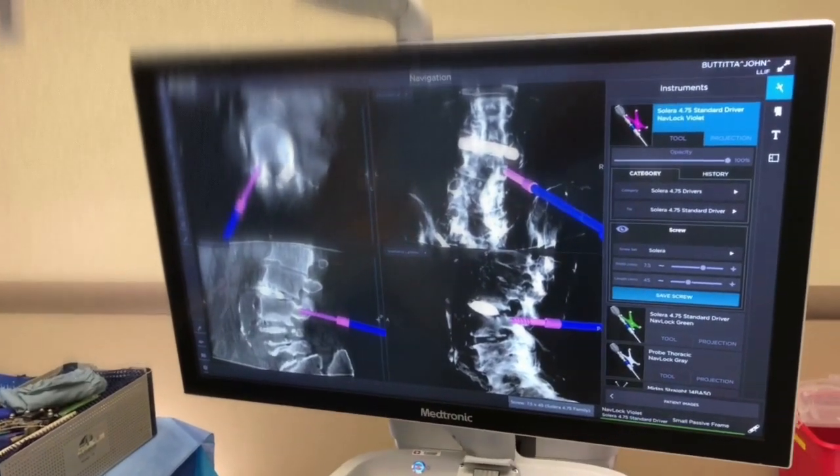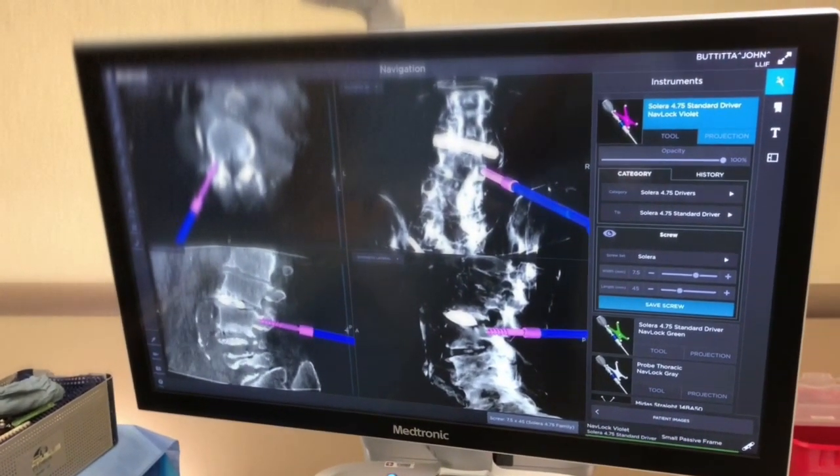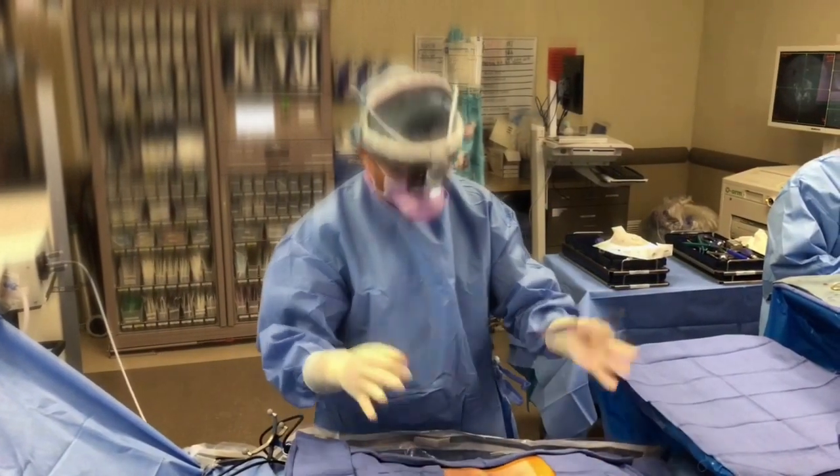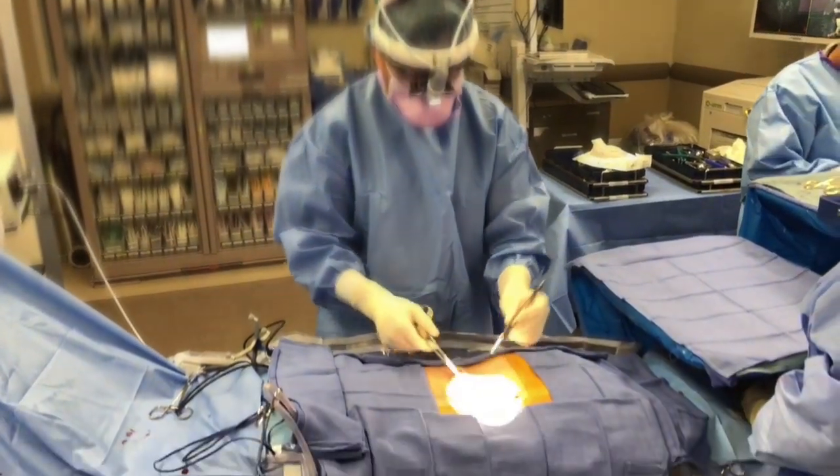That's the pedicle and that's why these are called pedicle screws. You have very good bone — this is getting a very good bite. We're finishing up. I have all the screws in. Here are the two little incisions that we're about to close.